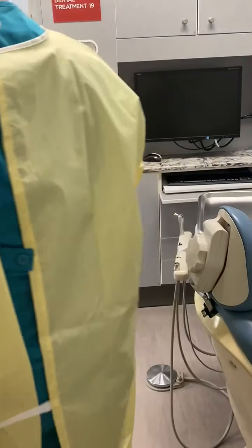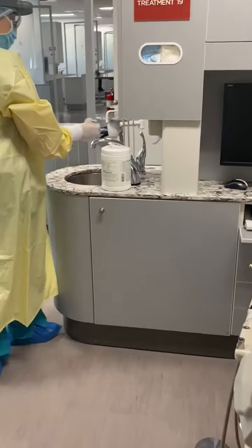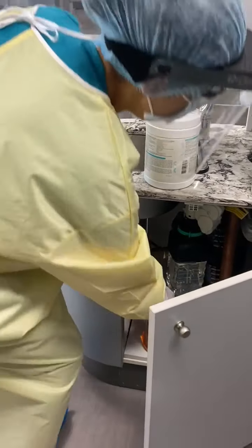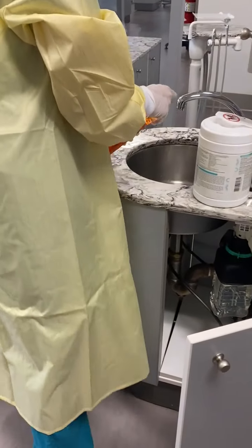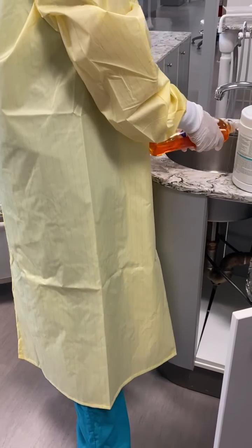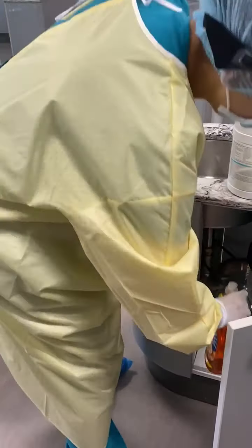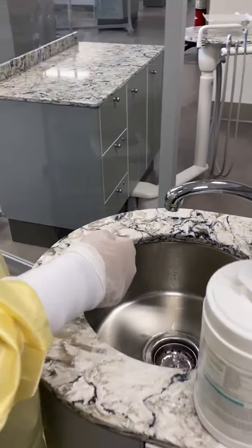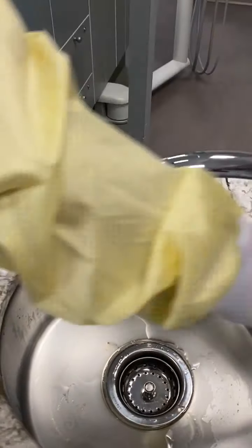Next, you will wash the sink with soap and water. You will use your foot again to open the door, add a couple drops of soap into the sink, and clean your sink out with a couple paper towels and water.